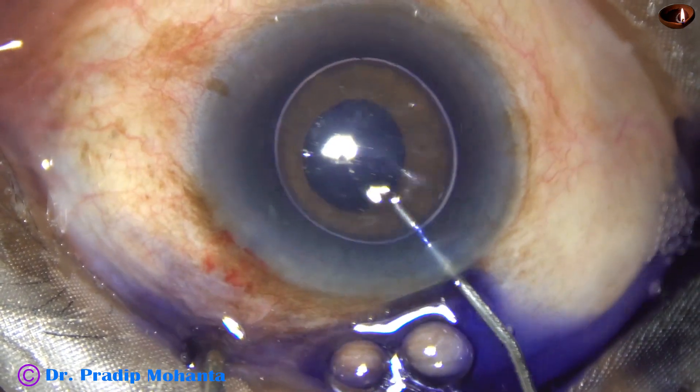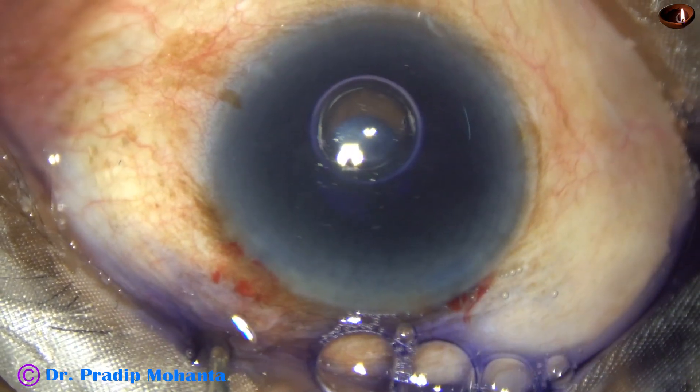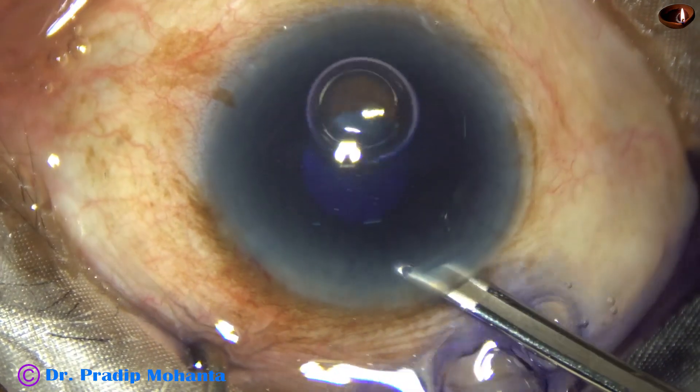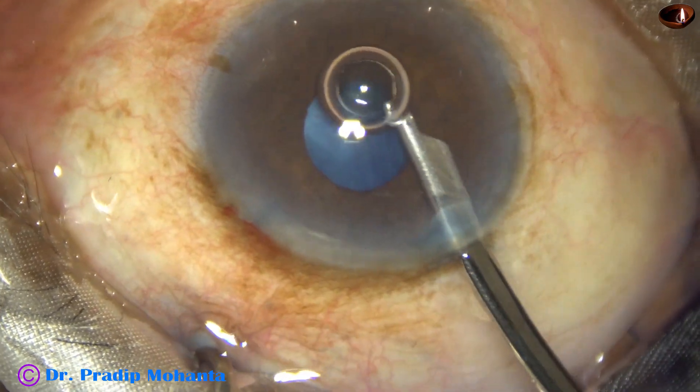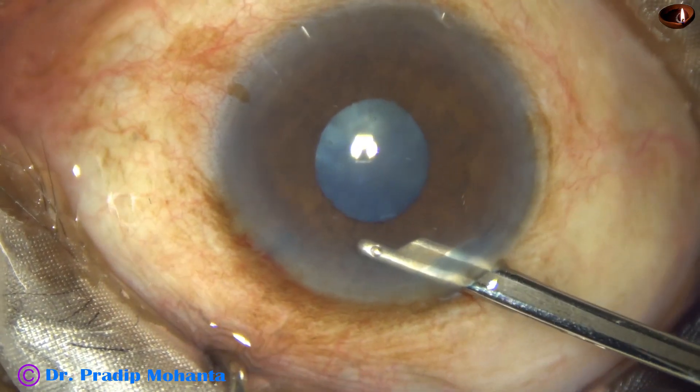This is adrenaline, but the pupil did not dilate in this case. This is a rigid pupil — we can say senile miosis — in a 90-year-old man.